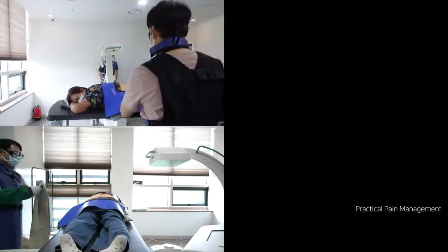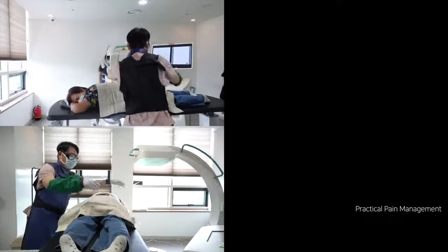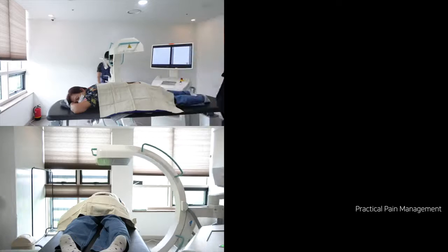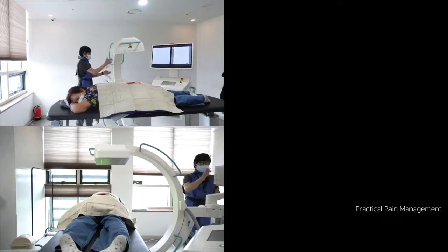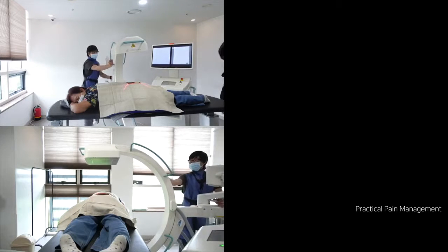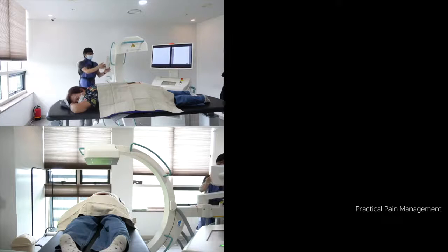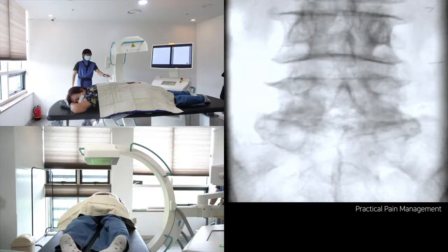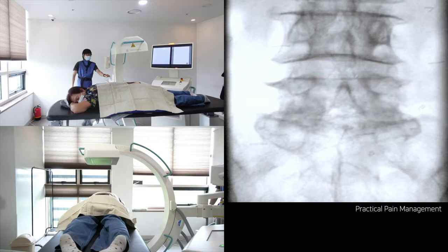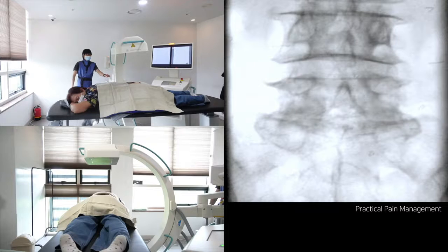Welcome back. I am Dr. Lee's AI speaking assistant in practical pain management. This is one of the videos that shows how much rotation and tilting is needed to find a target and approach the needle. The C-arm angle videos will help train your radiation technologist to develop aligning skills.